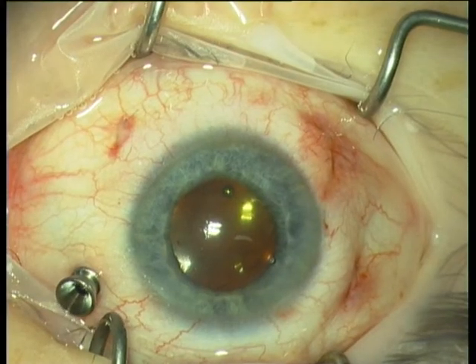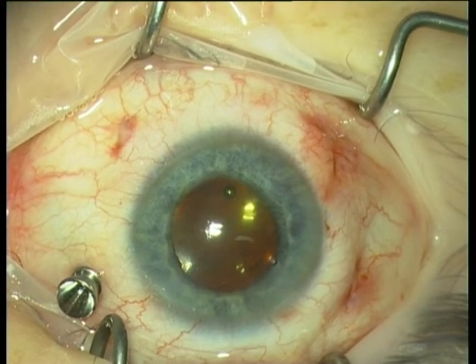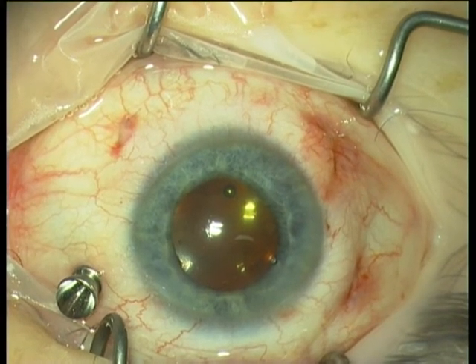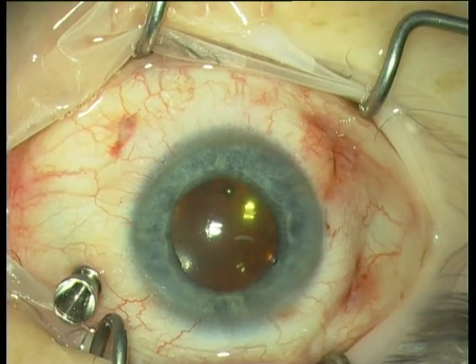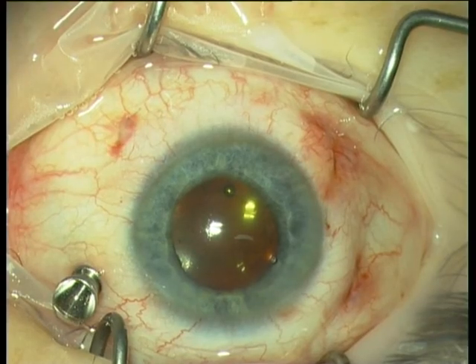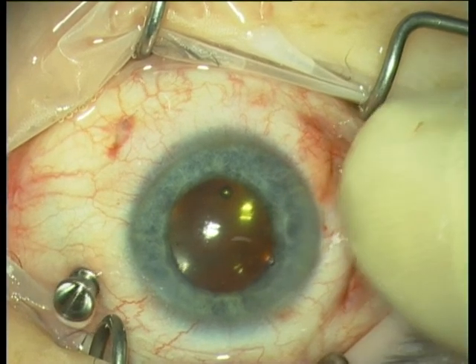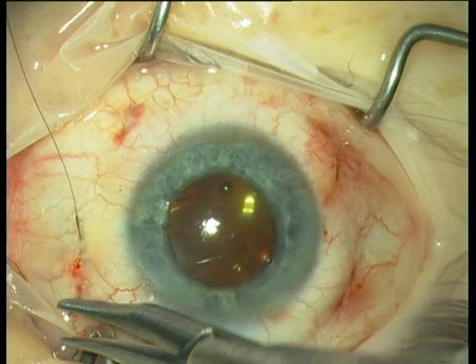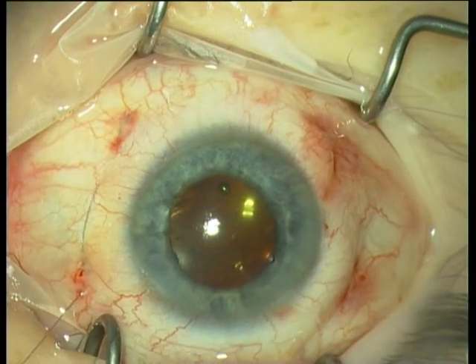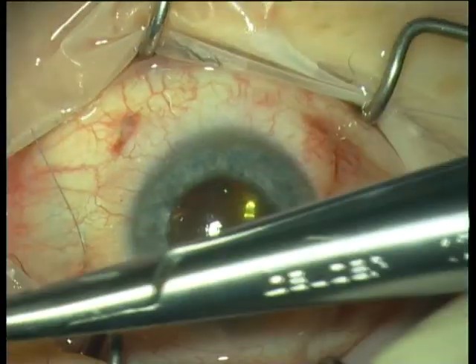Now I remove some residual silicone oil in order to have a normal tonus of the globe. And of course the sclerotomy has to be sutured.